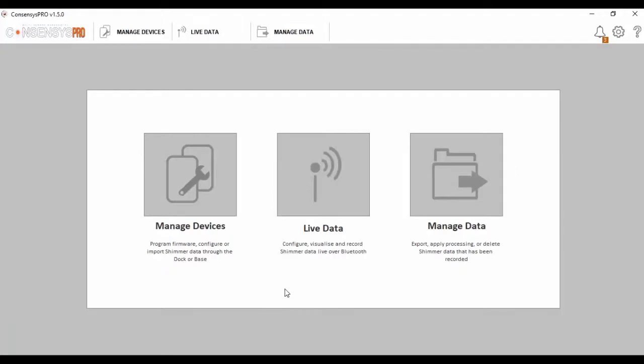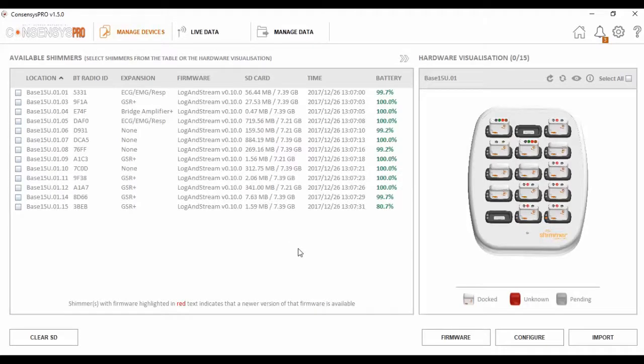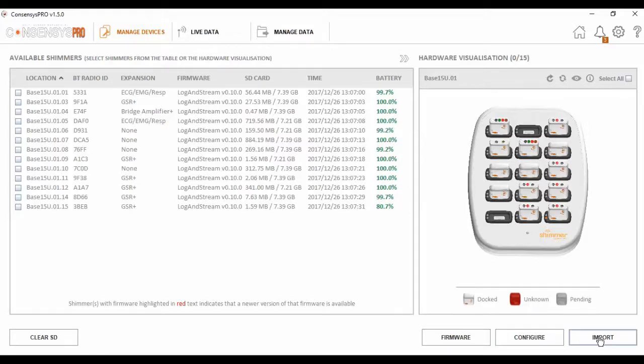I will explain the function of each tab in this video. The first tab is manage devices. This tab is essential for when you are starting your trial as it allows you to perform a number of functions including programming the firmware, configuring the devices, and importing the data from the device's SD card. All these functions should be considered before you start collecting data.